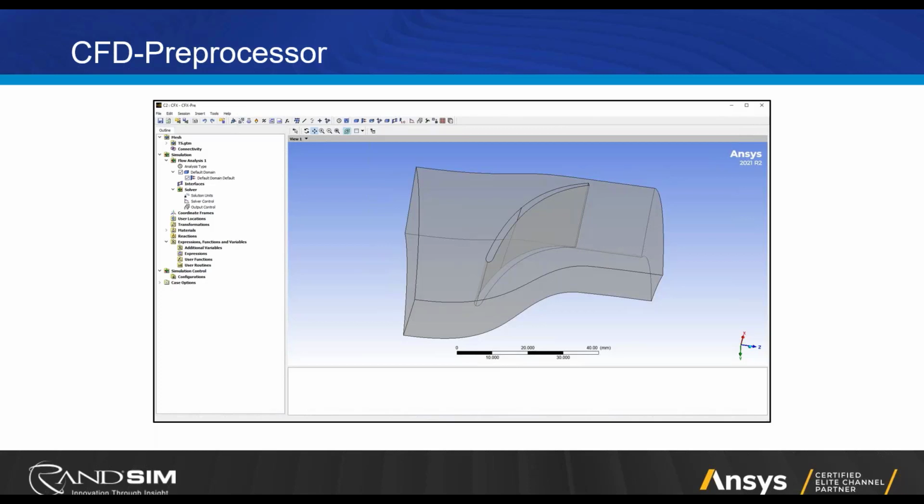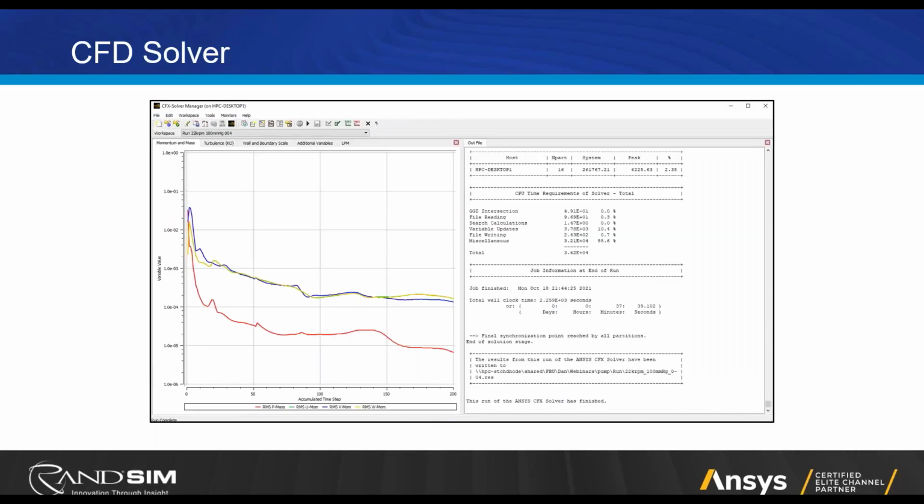Instead of having to model the entire wheel, we just model one blade, and we have periodic boundaries, which say whatever goes in on one side leaves on the other side. So that allows you not to have to model the full 360 degrees of the wheel. You apply your material properties also here, and then you're set to run the solver, which is in the next slide. So this is what the solver manager looks like.